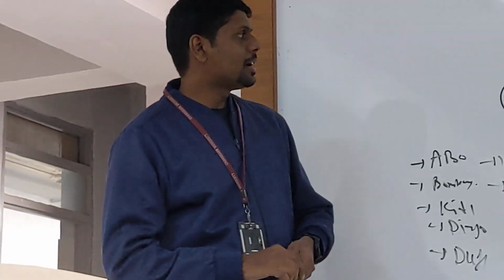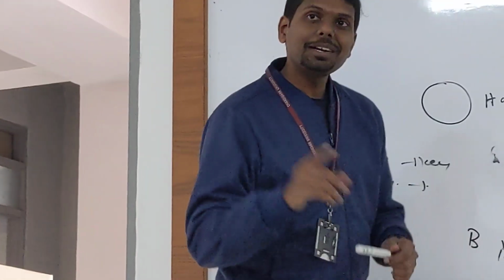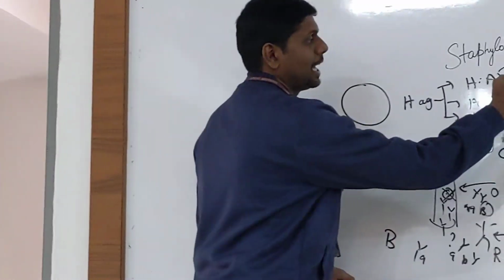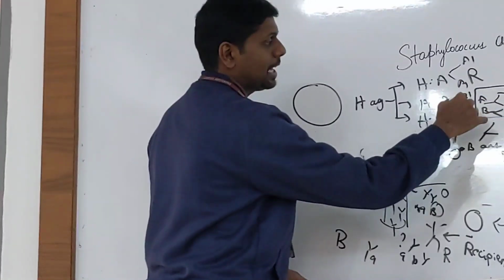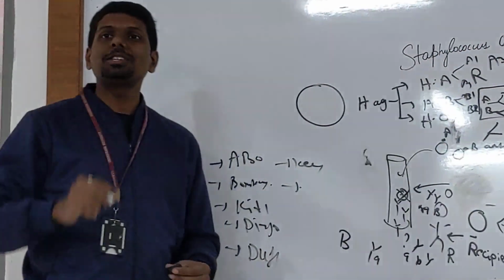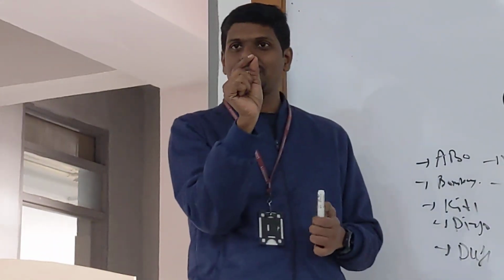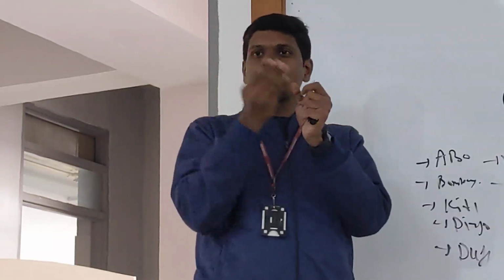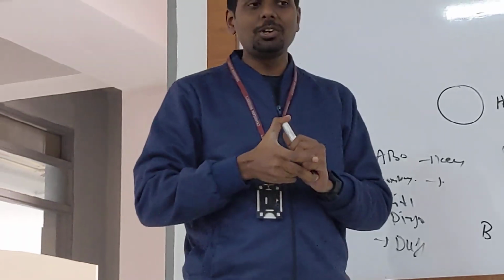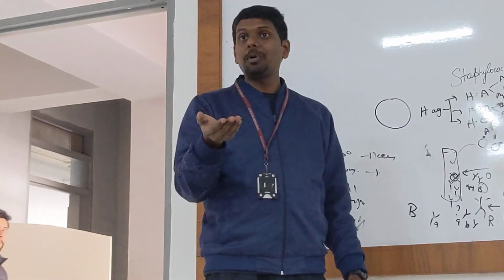Yeah. Now, in blood banking, we thought we would only do cross matching with ABO. But even in A group, we have A1 and A2. And they will have some minor reactions also, B1, B2. Even A3 is also there. These are sub-antigens. It's not a complete antigen, it's a part of an antigen. Not a completely A antigen, but a partial A antigen is present. Again, for them, when we do the grouping, they look like O group, but they are A group only.